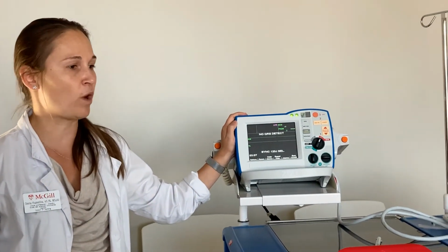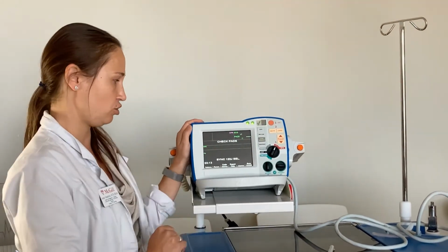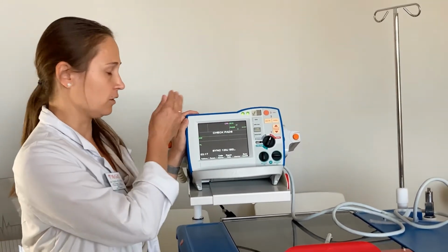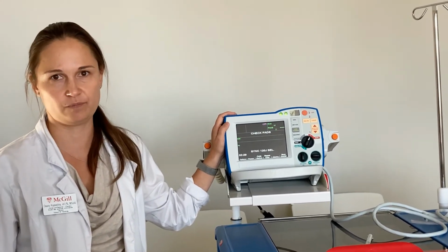prescription. So once you are connected and synced and you see a nice QRS complex, usually in your lead 2 that is displayed, and you see little dashes above them, you will ask your doctor, what do you want me to charge the defibrillator to? And according to the ACLS guidelines, the doctor will choose one of the energy levels to start cardioversion.